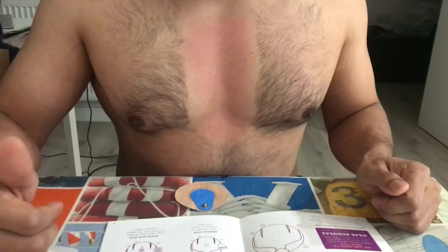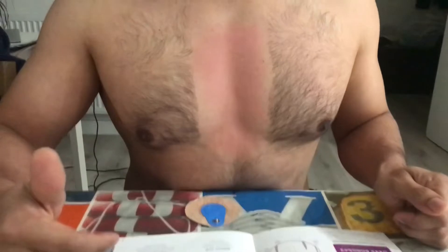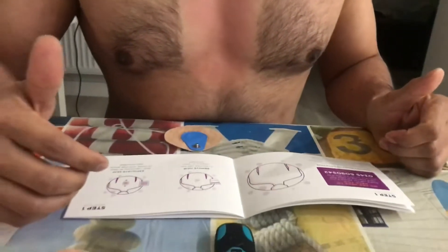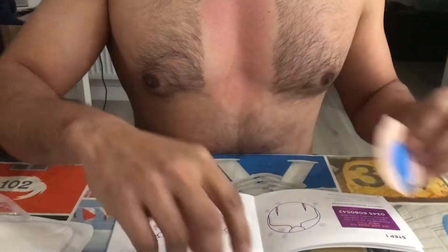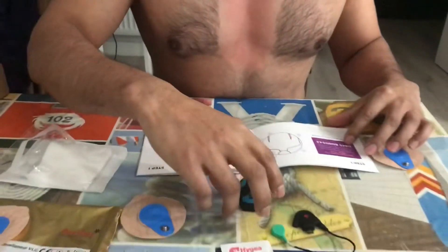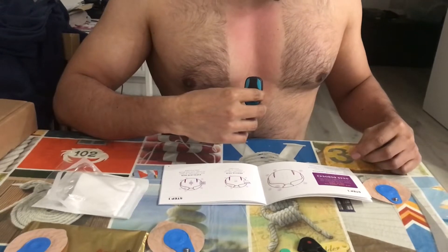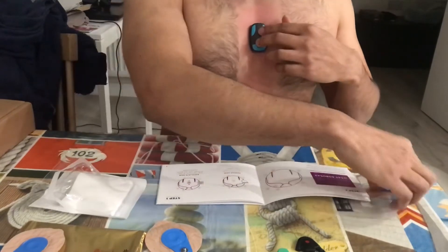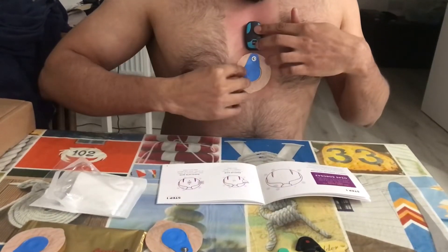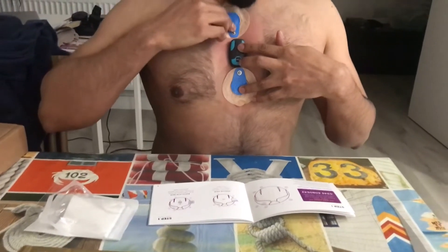One important thing to make sure: when you clean your chest, there should be no moisturizer, makeup, or anything on it. Make sure you clean it and then dry it up. I'm going to quickly measure where to put it — they advise placing the machine in the middle of the breastbone, so I guess that's going to be there. Then I'll place one electrode here and another one here, and then connect the cable.